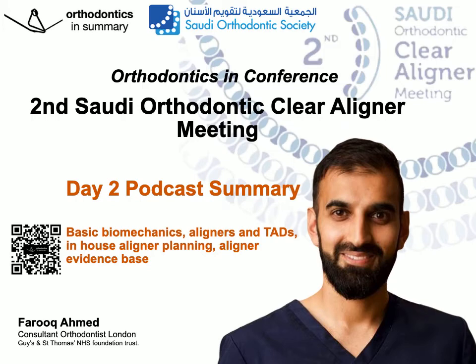This lecture is entitled Aligner Orthodontics in Growing Patients, a research-based approach by Tommaso Castroflorio. Tommaso started off by describing the ideal time for expansion to take place prior to lateral incisor eruption, and he quoted Bjorn Zachrisson and Marco Rosa for this.